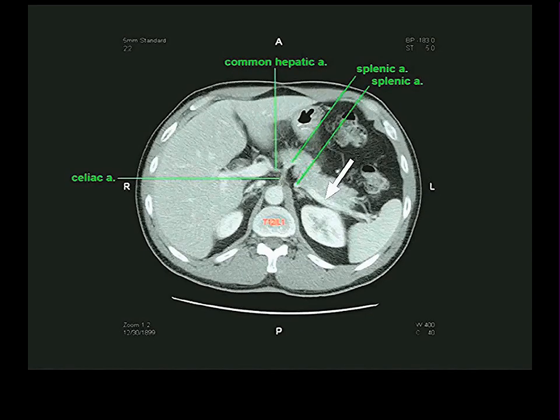So this vessel that I see right here, it's not labeled here, but I should have labeled it. That's a vessel that does not run along the upper border of the pancreas. That's a vessel which runs posterior to the pancreas. And that's a nice straight vessel, too. It doesn't have waviness to it. So that, in fact, is the splenic vein, which will be labeled on another slide. So all we're seeing here is the splenic artery, at this point, just near its beginning. In fact, no, this is a bit, too, because it's curling around here. But we've come to this vessel right here.